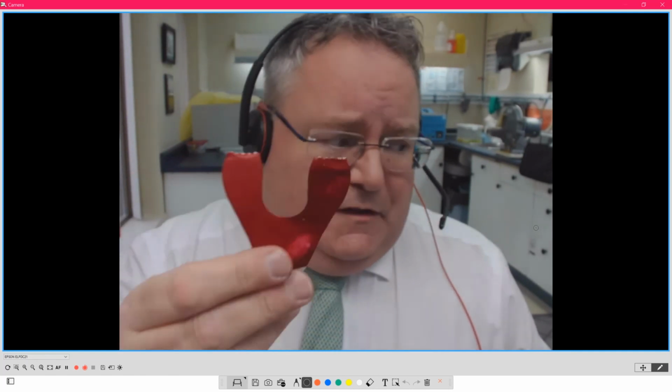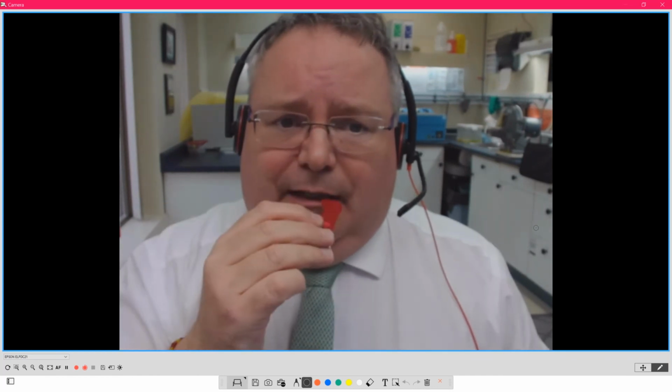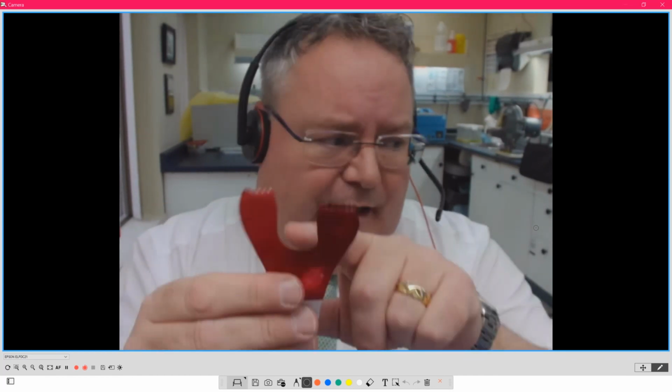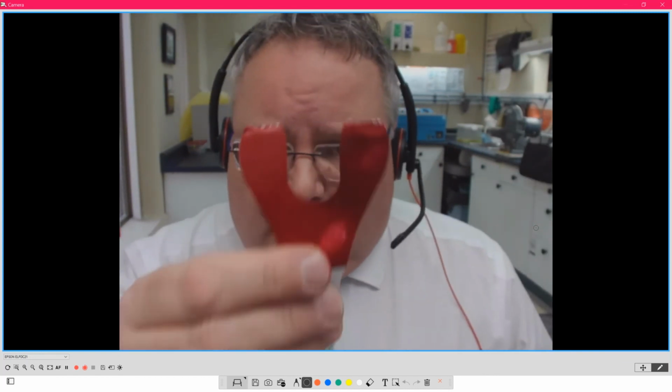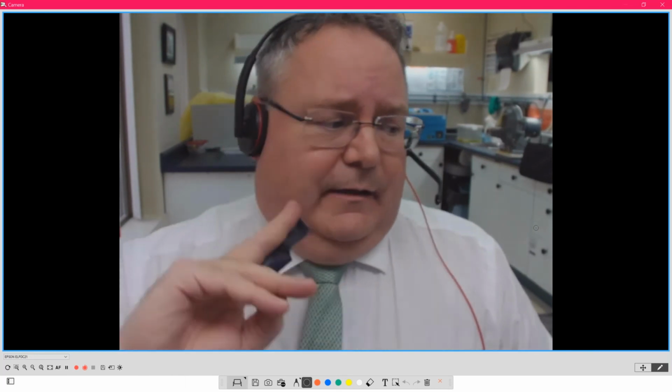Remember, when you put articulating paper in someone's mouth, the first thing on horseshoe articulating paper is their tongue's going to hit this and it's going to retrude their tongue. So your bite's off. So don't use this in the mouth. So then you say, yeah, Mark, but then I'm going to use the calipers and I'm going to hold it in and then I'm going to do that.